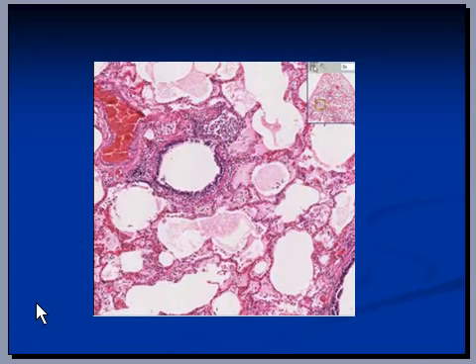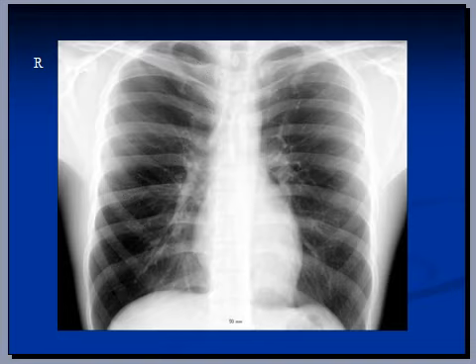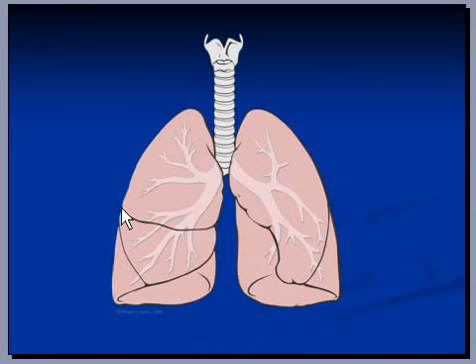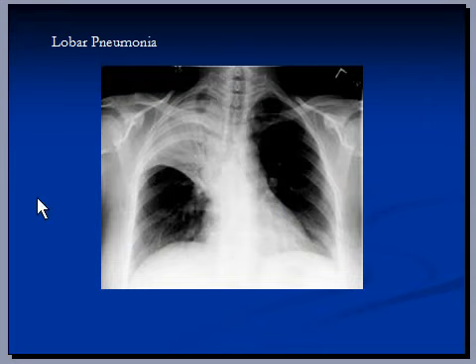This type of pneumonia is known as bronchopneumonia. There is another type of pneumonia we want to discuss today. This is a normal chest x-ray and this is a chest x-ray that shows consolidation in the right superior lobe. This is the horizontal fissure, which is visible here, and this is the oblique fissure. The infection is limited to one lobe only, and you can also see air bronchogram here, which often indicates infection.